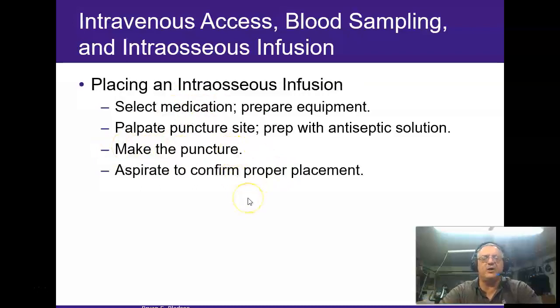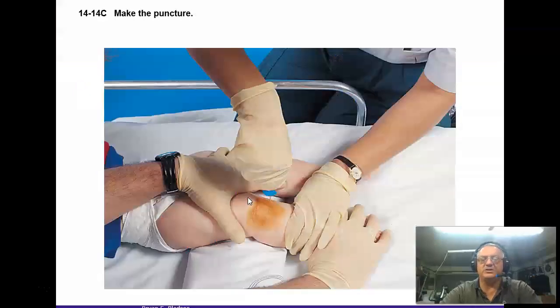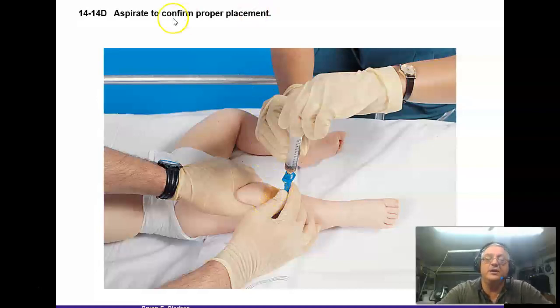But when you place an IO, make sure you clean the site well. Again, you're going to clean it. You're going to find the location, usually the flat part for there. We talked about, once we started them, the humeral IOs. Remember, this guy down here, it's good for about 1 liter an hour. For the humeral head IO, they're about 5. The reason we usually don't do it in kids is because of the growth plates. Usually a kid below 5, we kind of go for the tibia. It's not to say that you can't use the humeral head.